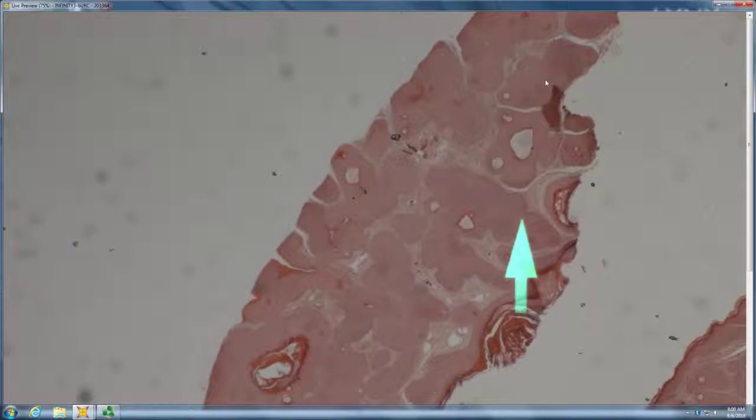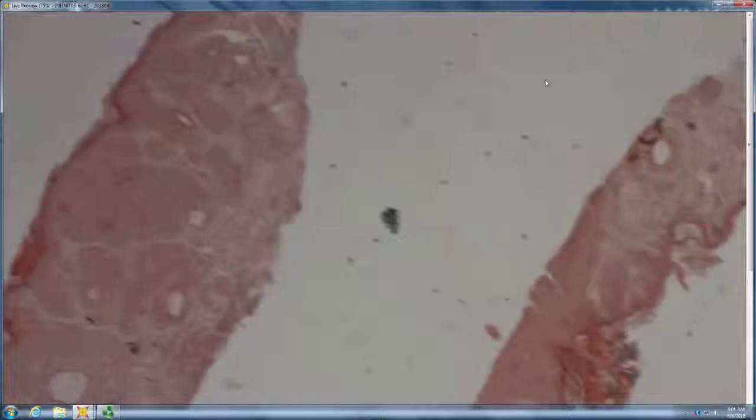So it is more pink than blue, like a trichoadenoma. It's differentiating up towards the infundibulum, so it's more pink than blue. And this one is very acanthotic, fat fingers radiating everywhere out, essentially, but they're not forming hair fibers. So that is a pilar sheath acanthoma. But it's many of them. They're all radiating out, so they often are multiple like that.